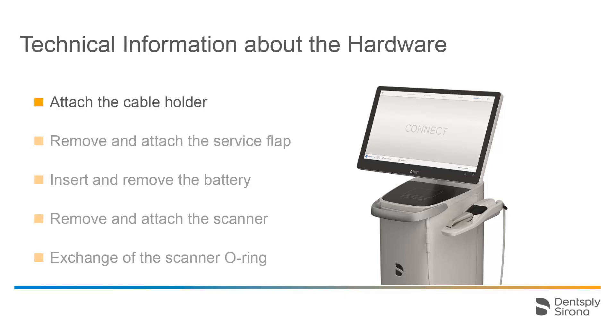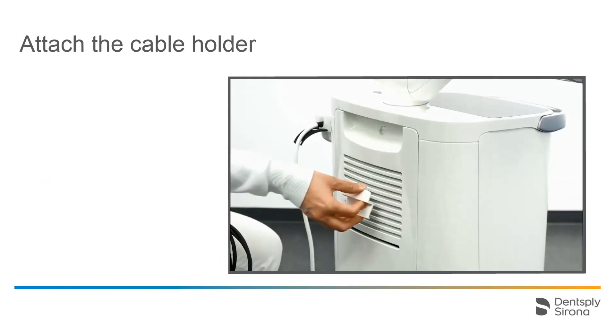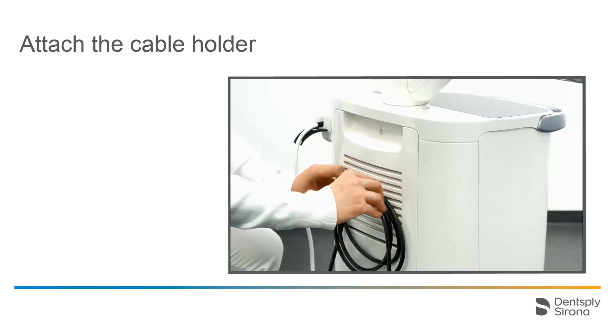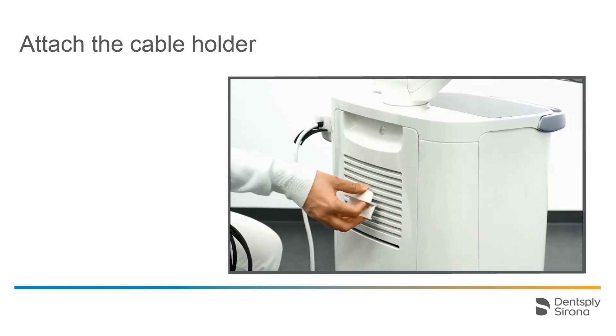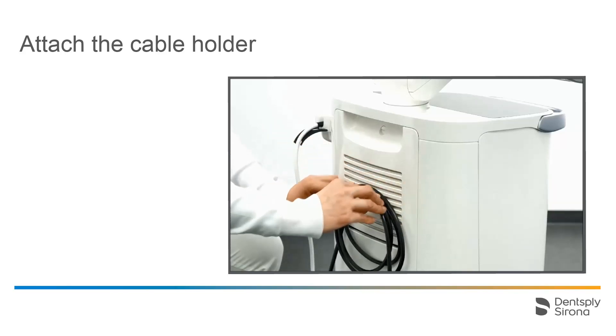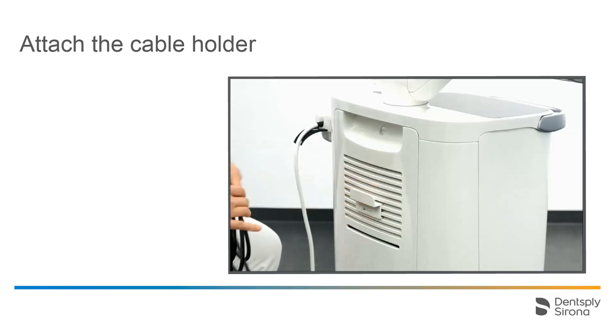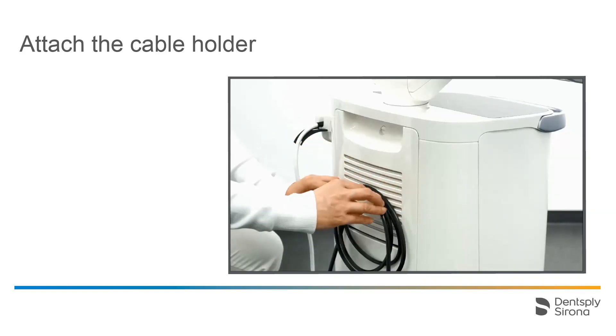To begin with, we will show how the cable holder is attached to the service cover. The cable holder is included in the delivery. It is tilted slightly to click it into the ventilation slots of the service flap. This allows you to securely store the charging cable of the CEREC Acquisition Center and to easily move the Acquisition Center between treatment rooms.